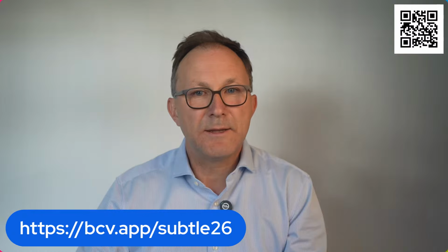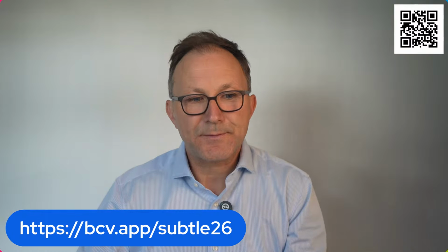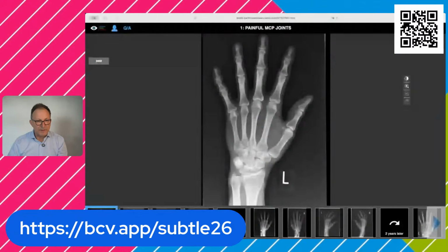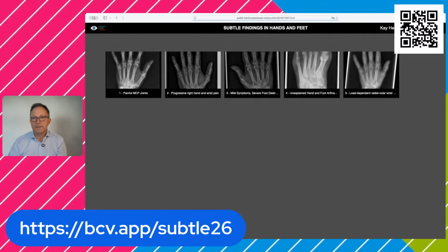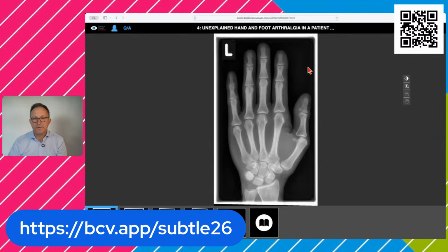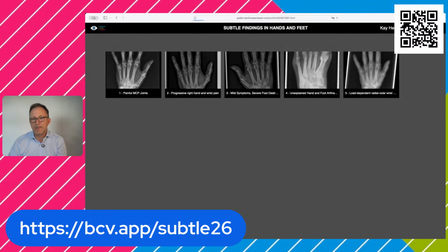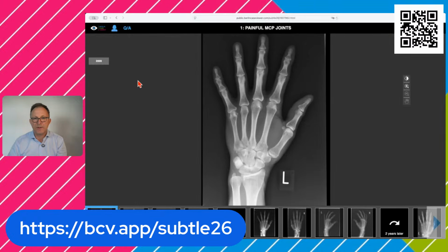Looking at the first case, I need to share it. It was not visible. So these are the cases, 5 cases. Case 4 and case 5 have a multiple choice question, so you can answer and we will see the results later. And here we have case number 1. That's quite a long case.